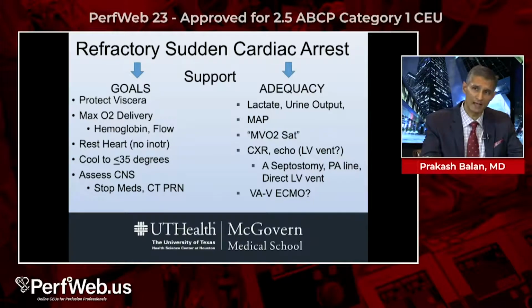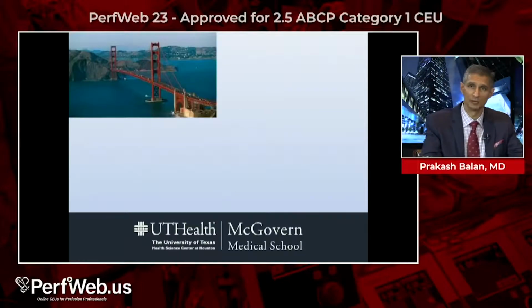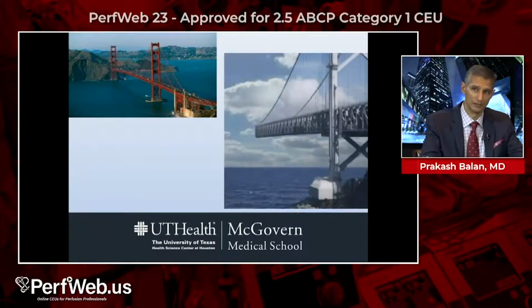In terms of the adequacy of your support, what you want to look at are some of the things that Kimberly talked about earlier, bringing down the lactate level. Is there a urine output? Maintaining a mean arterial pressure, mixed venous oxygen saturations. And we'll talk about the needs for lung support as we go along. The idea here with ECMO is to provide a bridge to both diagnosis and treatment of the underlying cause. Your goal is to have a nice, beautiful bridge to somewhere, not put the patient on a bridge to nowhere.